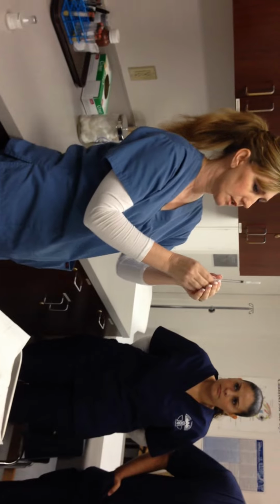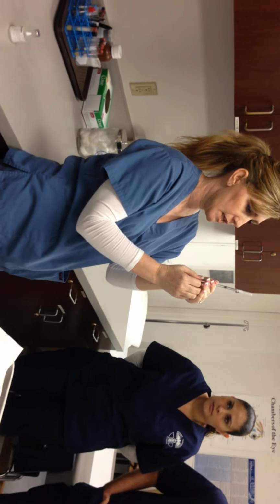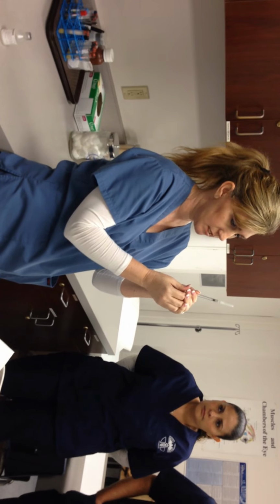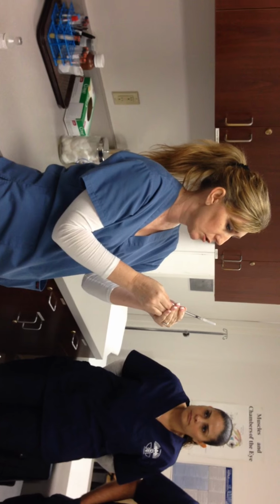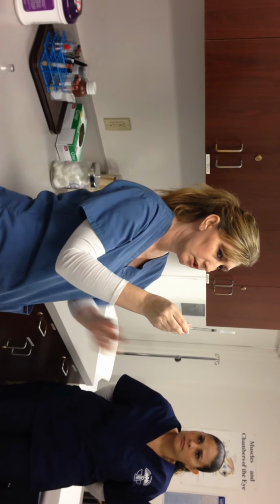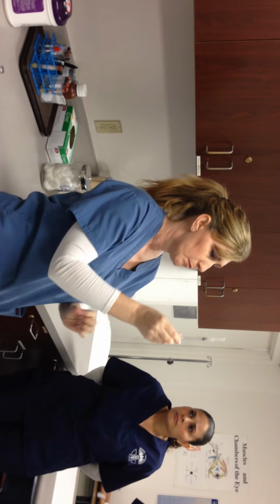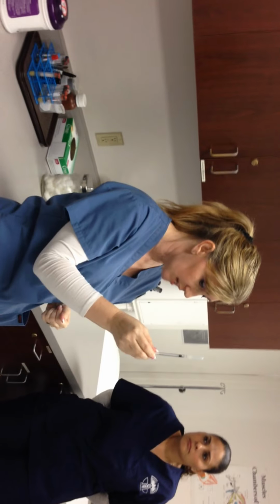And what's the first thing we do with our syringe? You guys remember? Exercise the plunger. Right? Like this. Make sure it's moving around. Okay, and I'm going to go down to 0.1 on my plunger here on the very top of it because that's how much medication I need. 0.1 for this particular test.